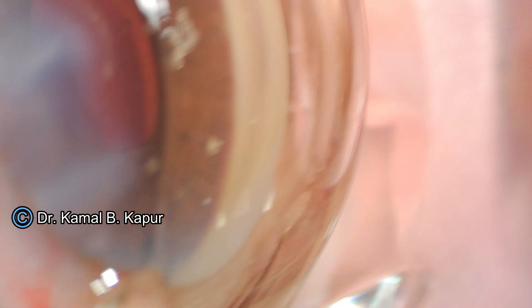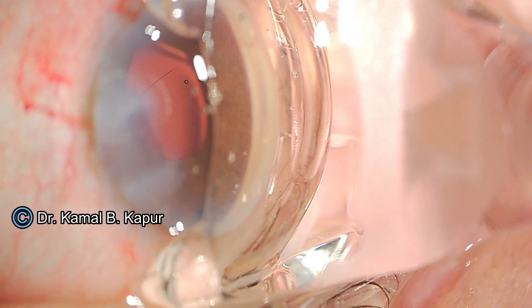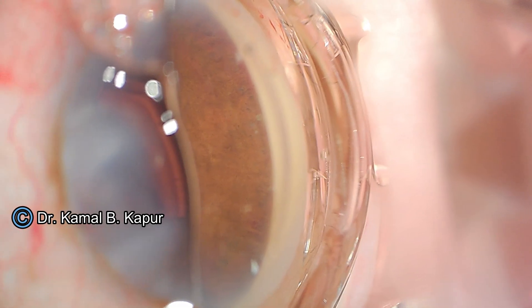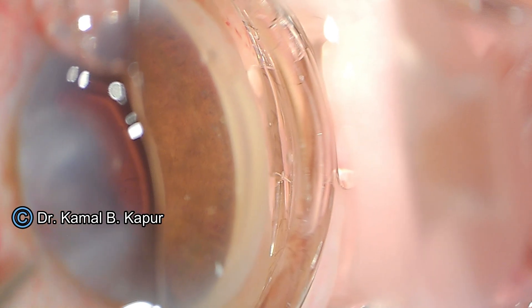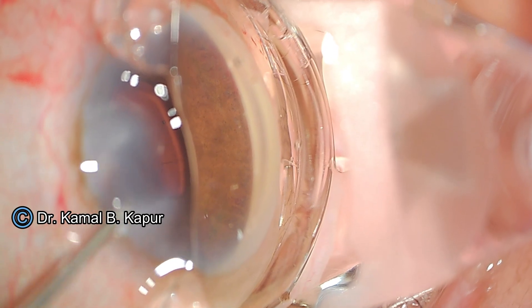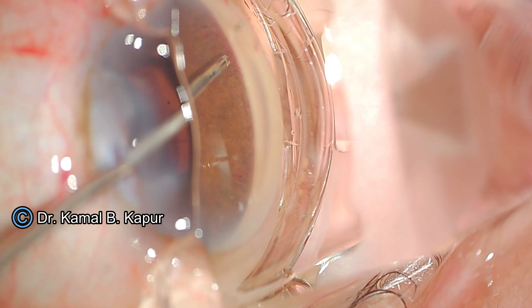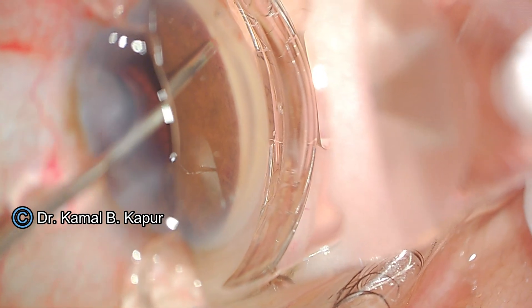In case you want to place a second stent in another area, you need to change your orientation of head and seating position. Once we have identified the trabecular meshwork, we instill viscoelastic and make sure all air bubbles in the anterior chamber are cleared. Under clear visualization, we may need to refocus or zoom out while inserting the injector plunger. We go absolutely straight inside the eye without dipping the wound so as to avoid leakage of viscoelastic, then pull the retractor to expose the firing pin, engage it into the trabecular meshwork, create a dimple, and push the black button.